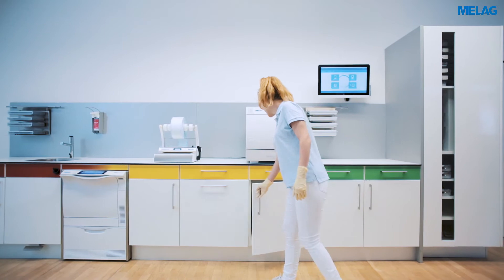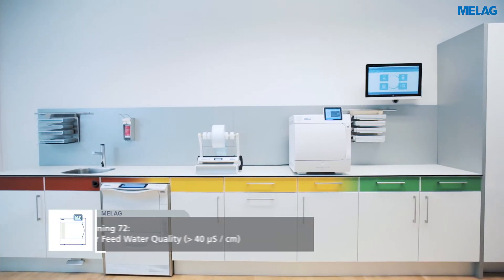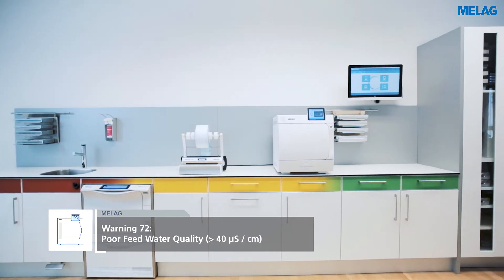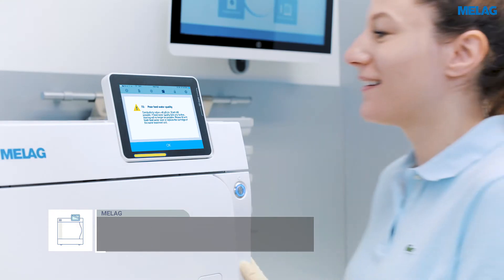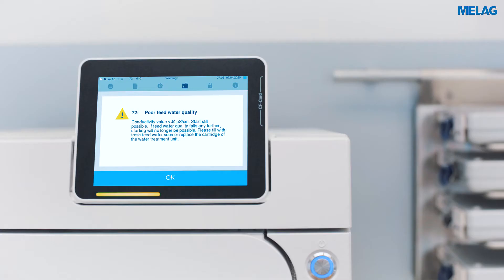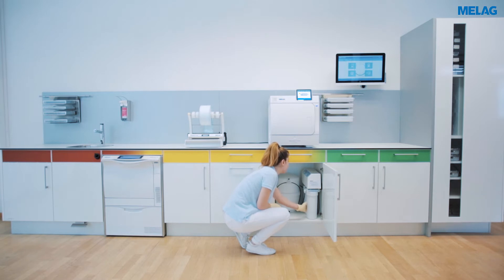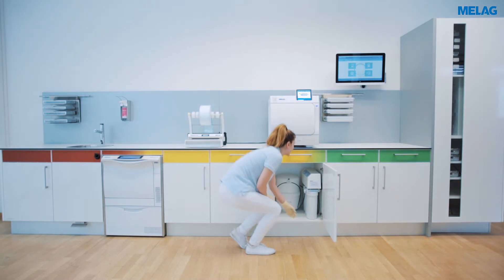The Meladem 47 water treatment unit supplies steam sterilizers with demineralized water. The Evolution series automatically tests the conductivity of the demineralized water during every sterilization procedure and issues a warning if the water quality is too low. Please change the mixed bed resin cartridge as soon as the warning is displayed.